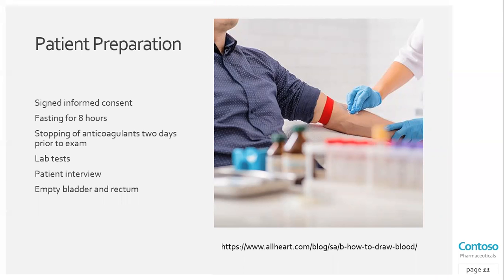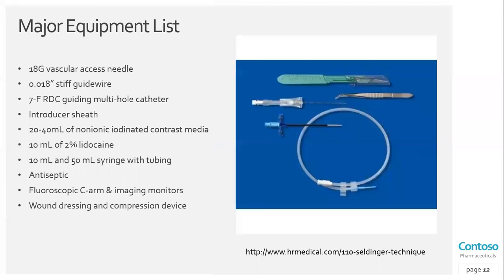A blood test may be ordered to test the clotting factors along with kidney function of the patient. Ensuring that female patients are not pregnant and inquiring if all patients are allergic to iodinated contrast dye, specific medicines, latex, tape, or anesthesia is necessary prior to the exam. Before beginning the exam, the patient will then be asked to empty the bladder and rectum as necessary.